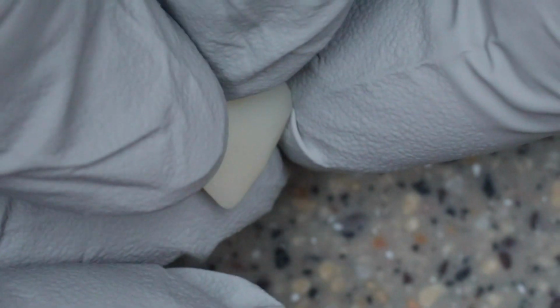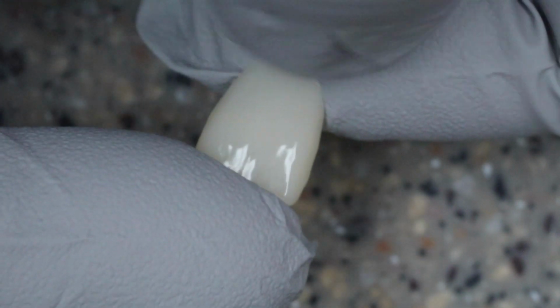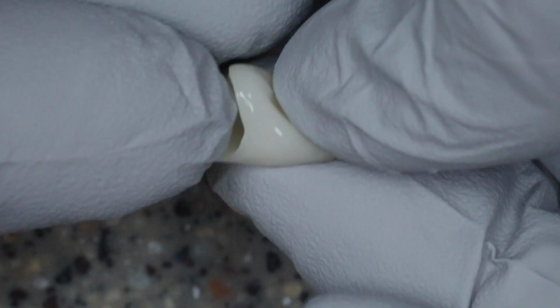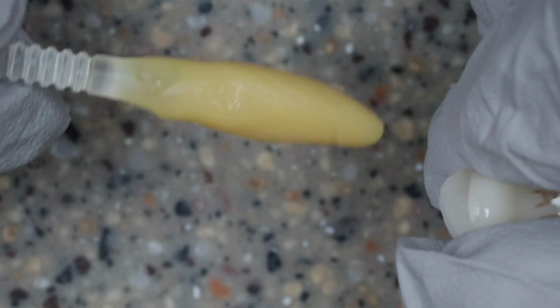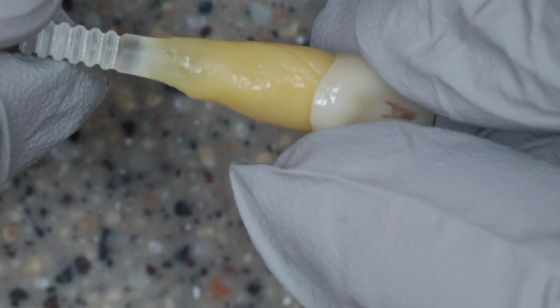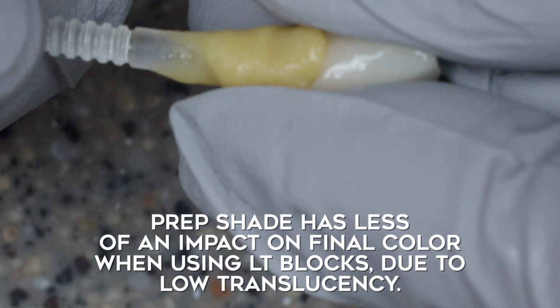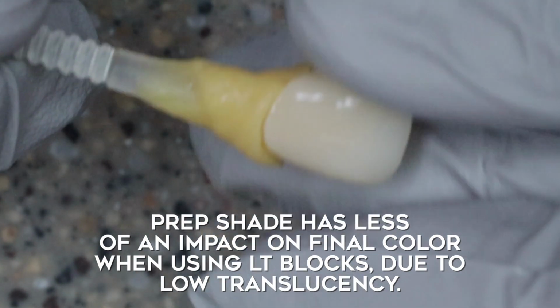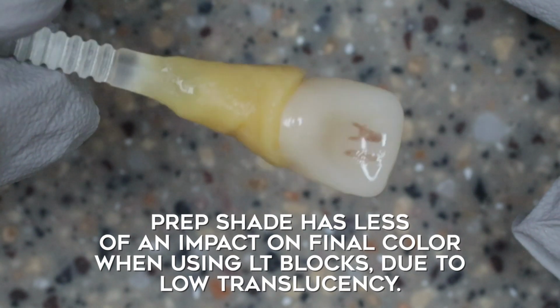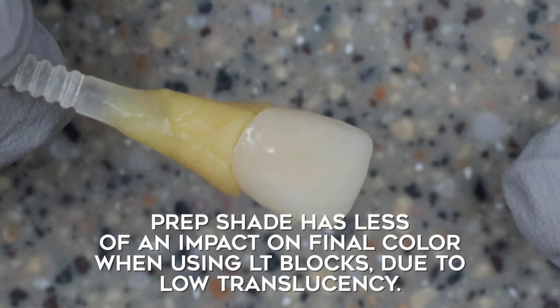So this gives me an idea now what my e.max A1 crown is going to look like after it's been fired and glazed. Now I'll have a series of these crowns that I can use after I've prepped the tooth. I can pull these out, find the natural die material that most closely replicates the prep, and then I can place this onto these crowns. And if I think, hey, I think this patient is an A1, then I place this onto the corresponding die for the patient, and I'll have an A1 crown on there, and then I'll put this in the mouth and I'll see how it looks with the natural teeth.